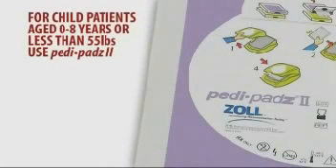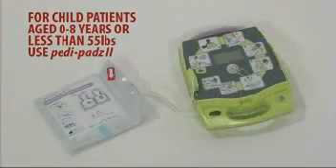If you are treating a child patient under the age of 8 or under a weight of 55 pounds, you must use the pediatric defibrillation electrodes labeled pedi-pads too.